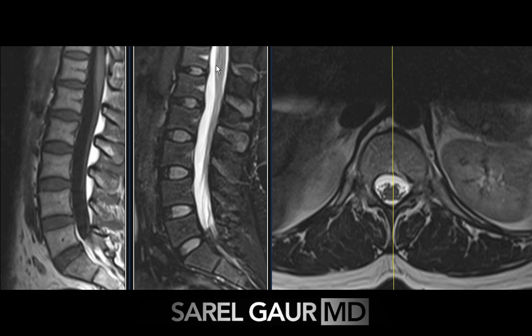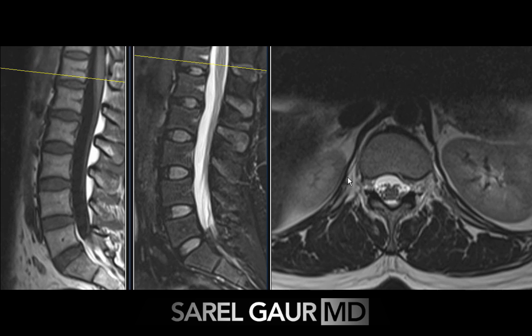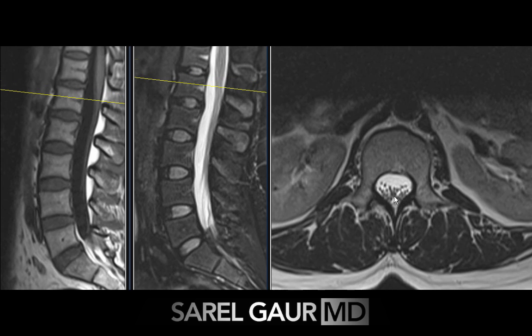I then move on to the cord. I'm looking for any masses within the cord, any enlargement of the cord, or any abnormal signal within the cord. I'm looking at how the cord terminates into the cauda equina. I can use the axial images to help me find the termination — the conus. Here's my conus, and that's going to be at the L1 level.